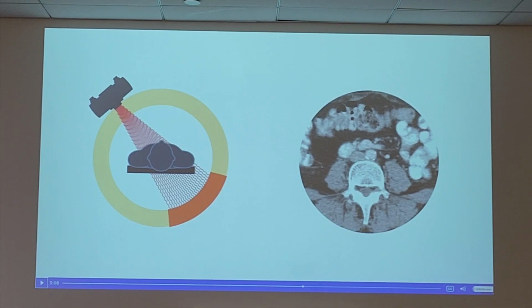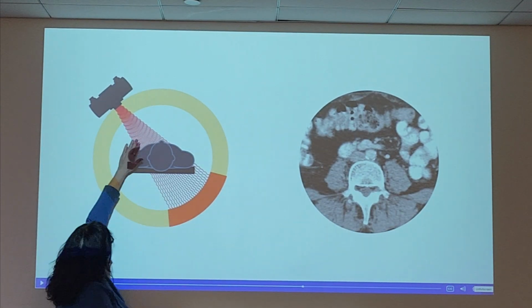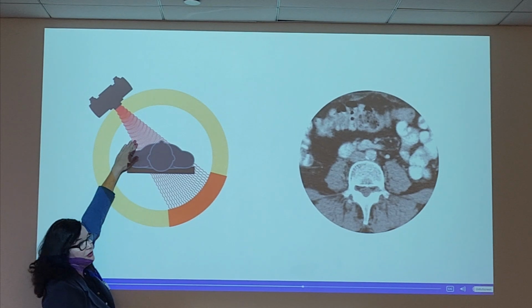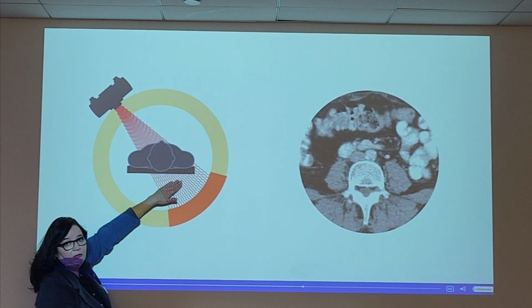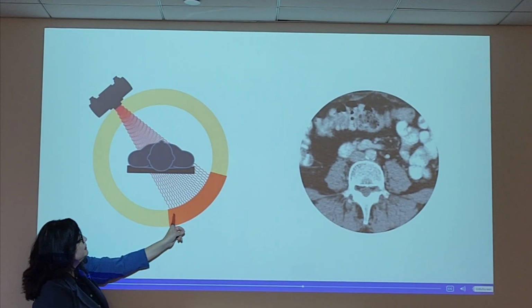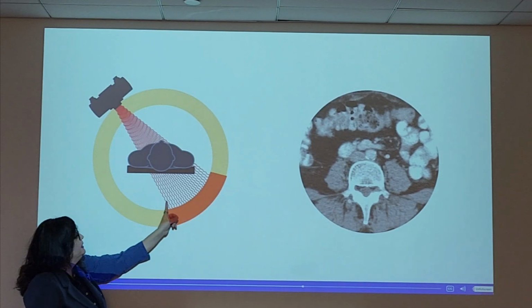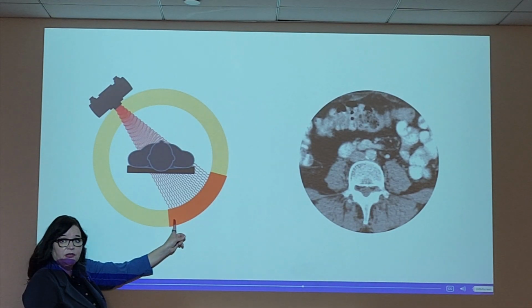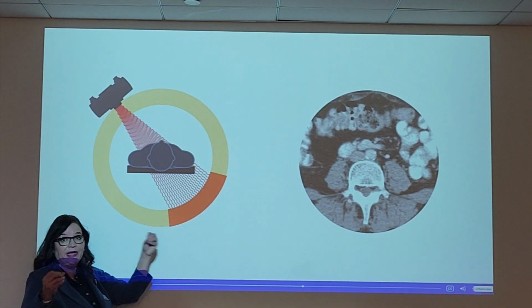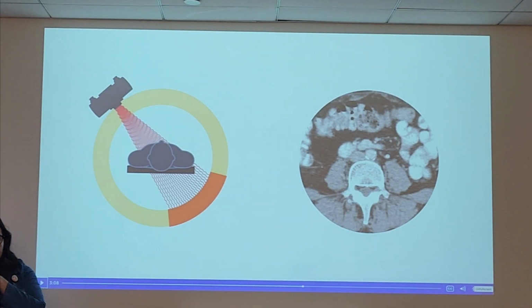So we're going to talk about kVp, we're going to talk about mA. But here we have the X-ray beam, pre-patient, the remnant beam, post-patient. The X-rays that were absorbed will deposit no energy, and a value will be assigned. The energy that deposits onto the detector is going to be assigned a value based on the amount of frequency or energy that is there. Is everybody with me? Is it okay for me to repeat it?